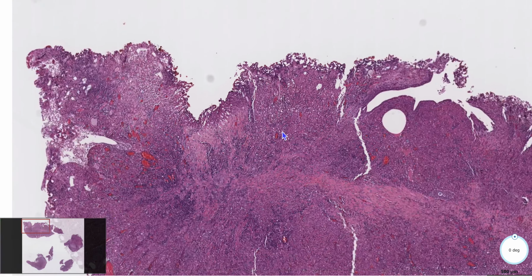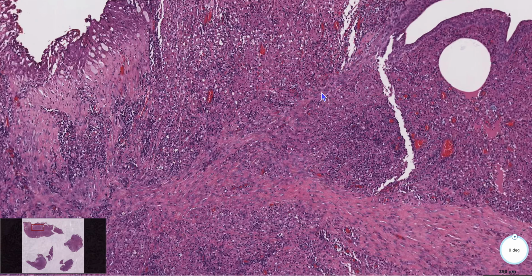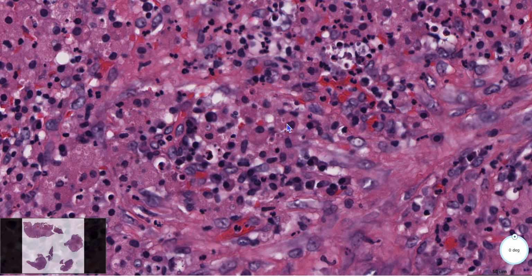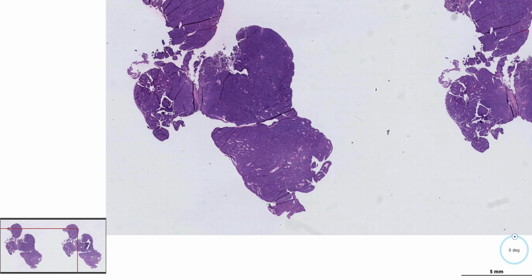So to recap, Malakoplakia is a response to the histiocytes that have engulfed undigested bacteria. You'll see foamy histiocytes that, I forgot to mention this, but will light up with PAS. And you'll see characteristic Michaelis-Gutmann bodies. All right, now we got that special treat done.